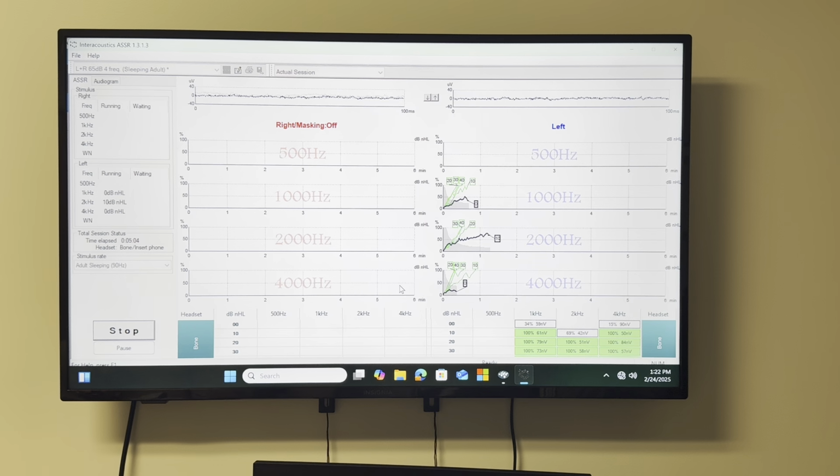If you go beyond what? 55 dB bone conduction. Stop and do 45? Yeah. And that's just because it would pick up interference in the neighboring frequencies. There's not much research done. I don't know how, they probably just did acoustic output measurement and saw. And that's because of the proximity of the bone to the electrode?